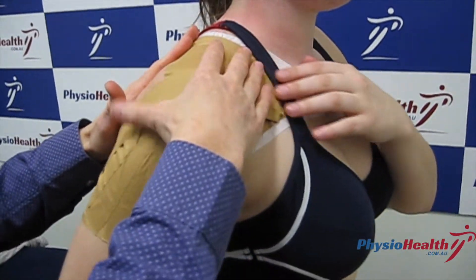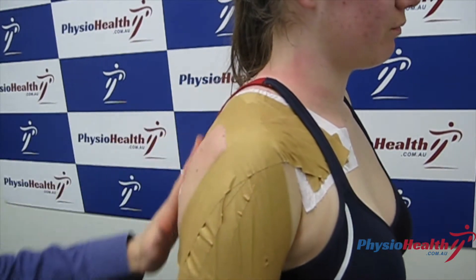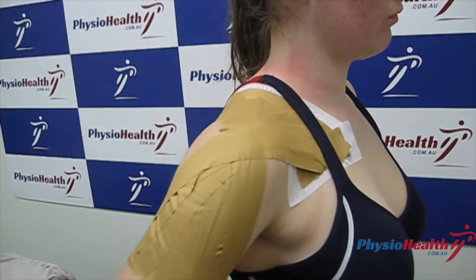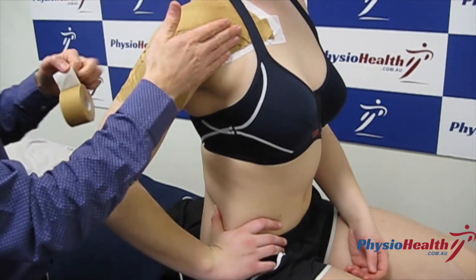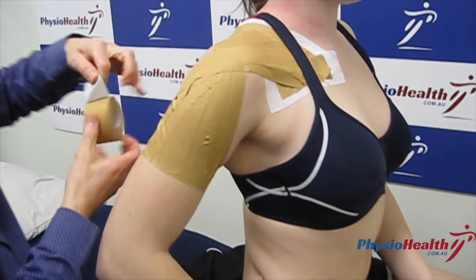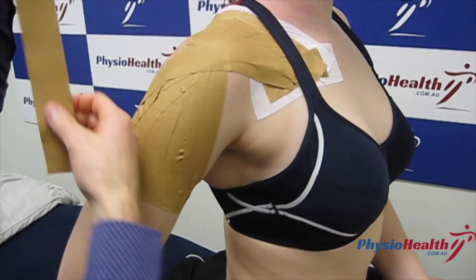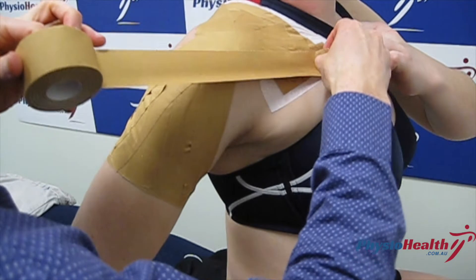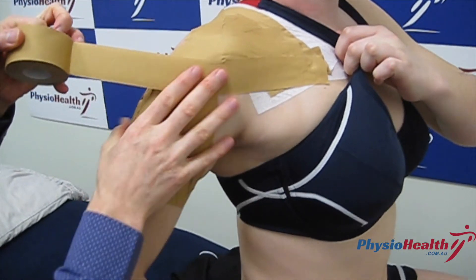That's basically the section for the AC joint, apart from locking off those pieces at the end. The extra bit, going back into that position, is for instability of the shoulder joint. We want some firm pressure at the front of the head of the humerus, so we start by coming right across the chest, with a nice firm pressure across the front of the shoulder joint.